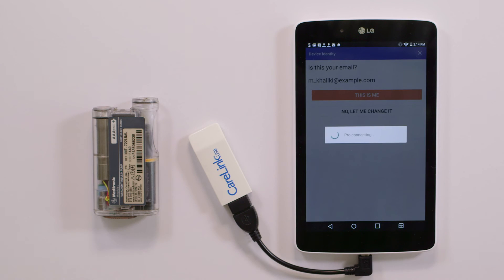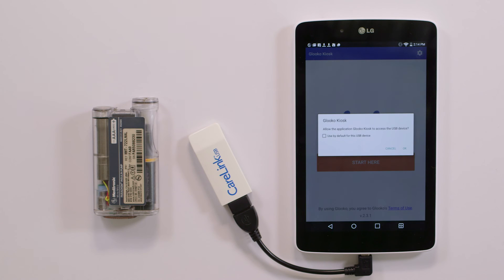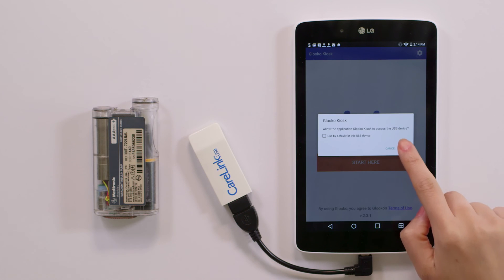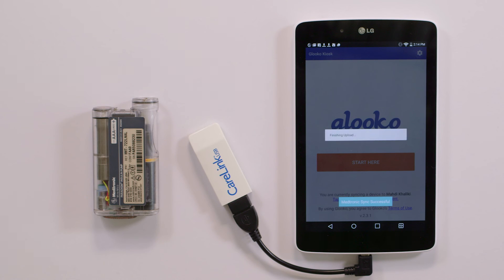Since Glooko Kiosk needs access to the Medtronic data file, you'll see a pop-up requesting that permission. Tap OK to allow access. The download will begin now.